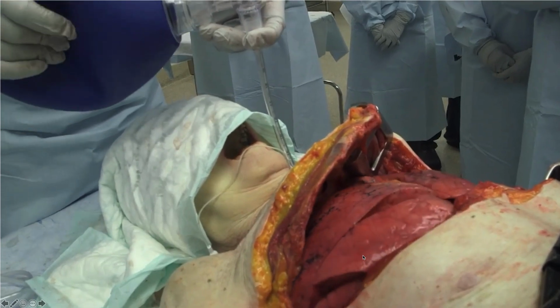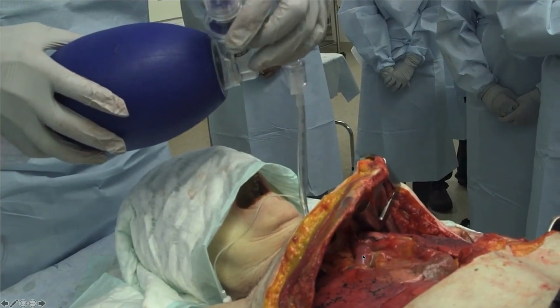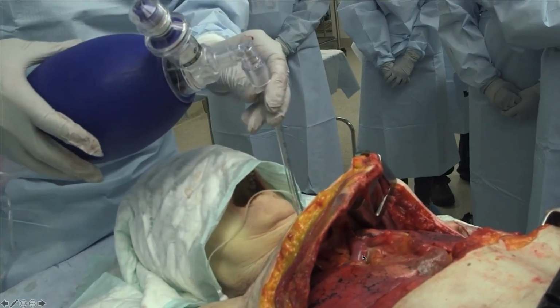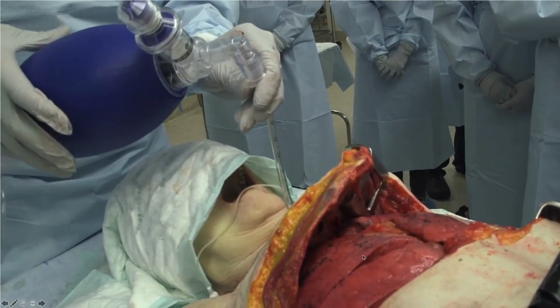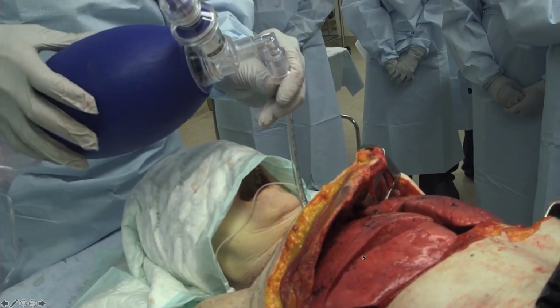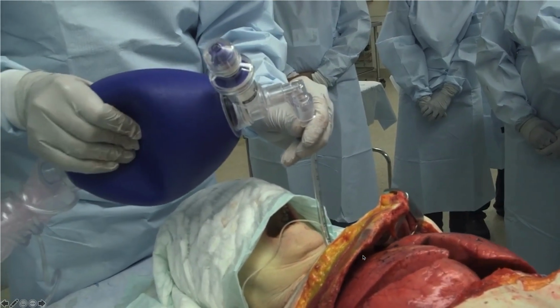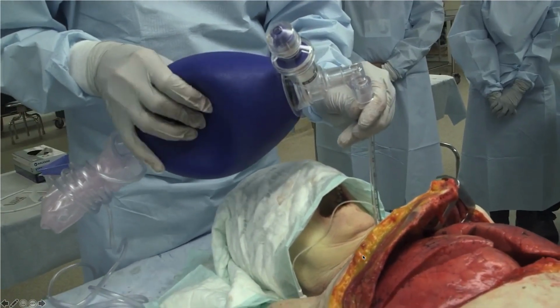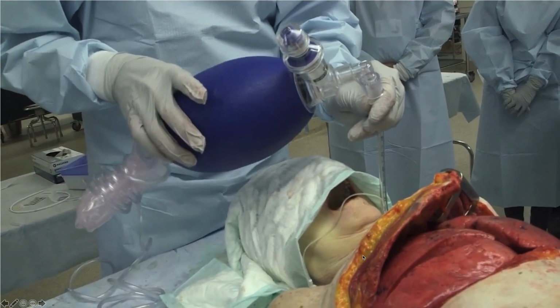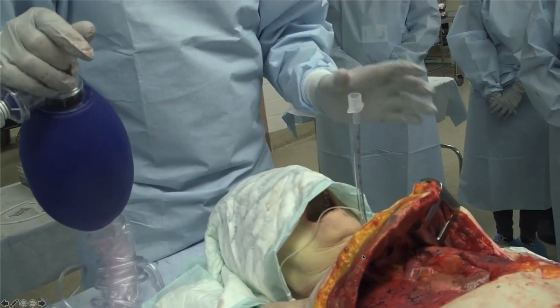If we look at a more real-life example of this, right here they're doing bag valve mask ventilations. You can see his lungs are collapsing completely down. Now he adds a PEEP valve, and within a few breaths, you can see his lungs are completely inflated and staying fairly inflated. They're not collapsing all the way down. So you can see how you're going to ventilate that patient much easier when you have that PEEP valve on. And now when he removes the PEEP valve, you'll see the lungs go back down.